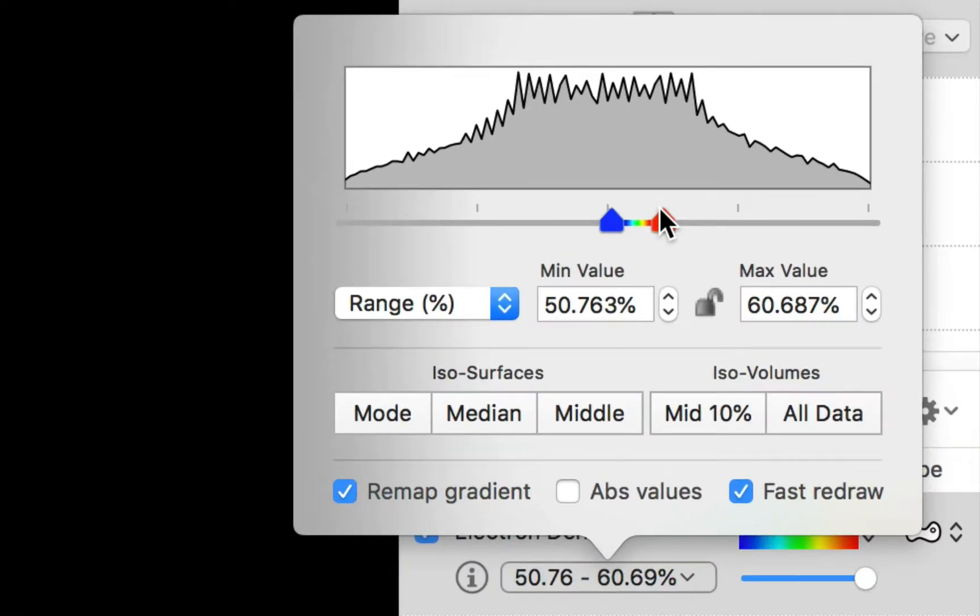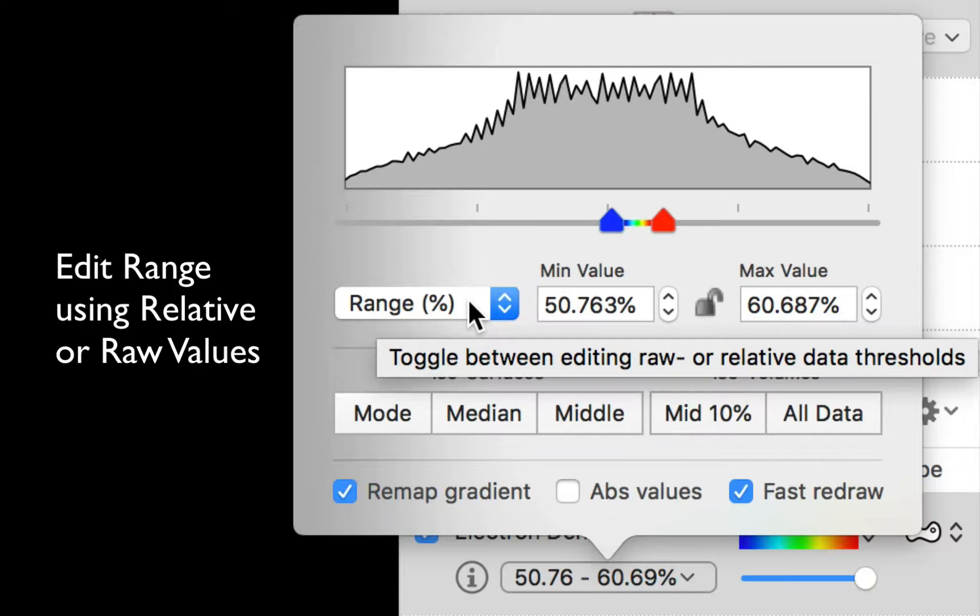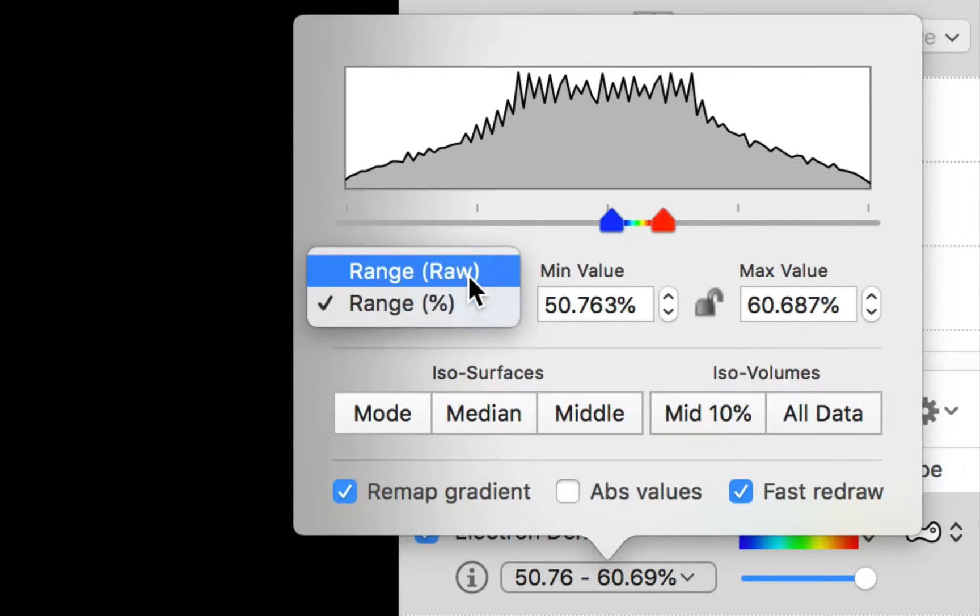Now you can be a little bit more precise by using the controls underneath the slider. There is a range pop-up which lets you toggle between adjusting relative values as percentages of the overall data range or original raw values.